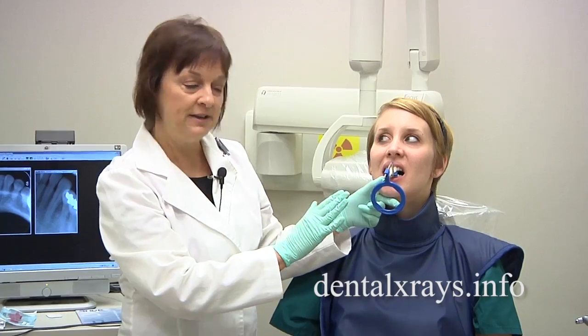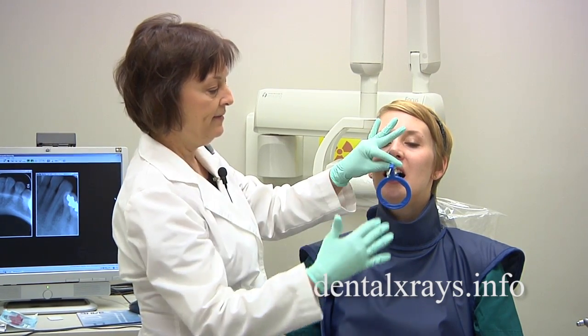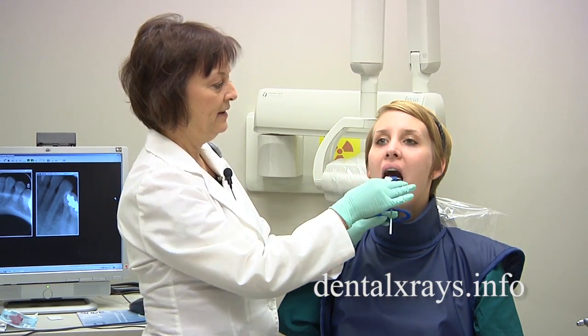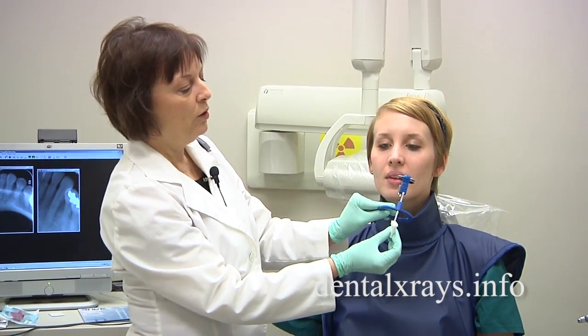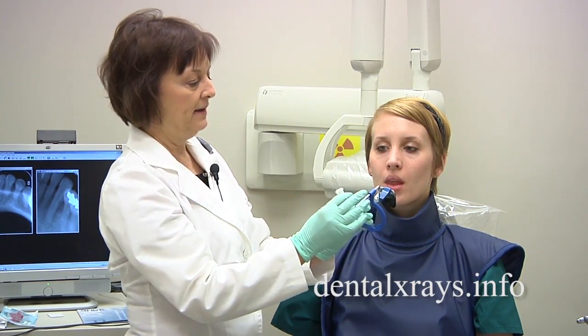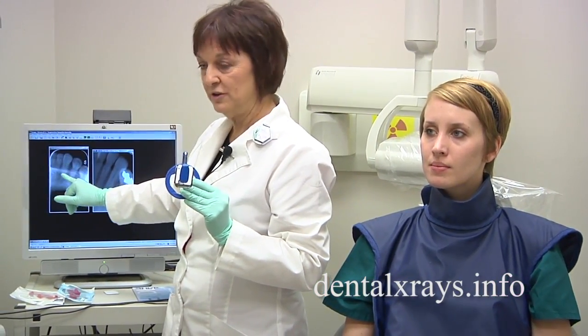Sometimes you have to readjust it a few times to make it work. Slide it in and then put your cone in to get the perfect picture. When I say roll the bar up before she bites, it helps eliminate a lot of foreshortening.